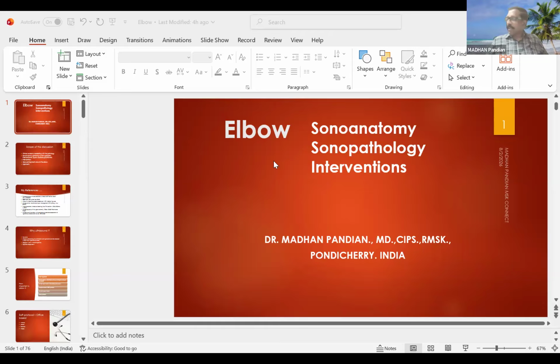Sir, I'll tell you. Ultrasound from an interventional pain physician's perspective is different from what a radiologist is seeing. Say, for example, you send for an MRI, and they say this is a distal biceps tendon injury. You are basically planning to do a proper intervention with a PRP. So how are you going to do a PRP injection unless you know how to scan the tendon? If it is only for making a diagnosis of distal biceps tendinopathy and I'm very sure, I think we don't need to.